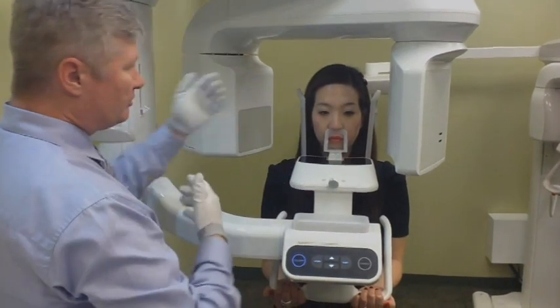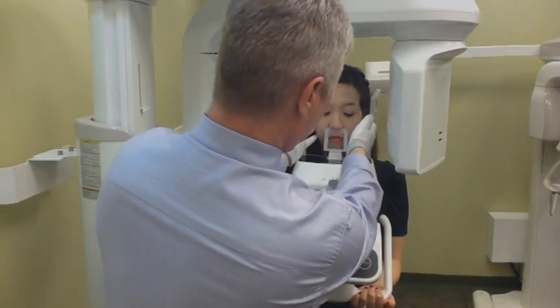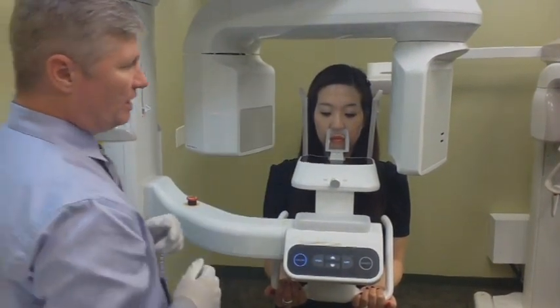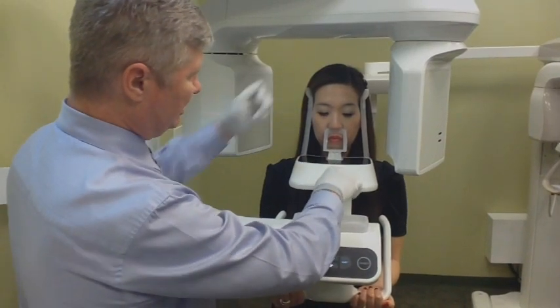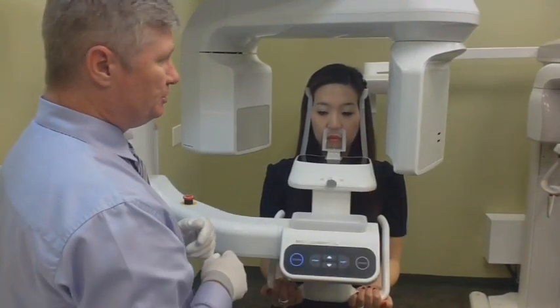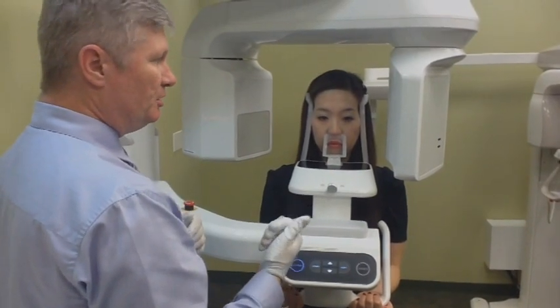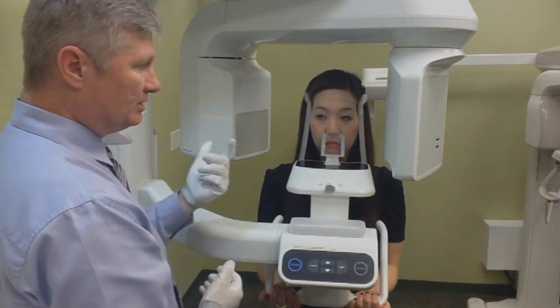The device height should be the same as the previous scan. Have the patient place the base of the nose on the appliance. Verify the Frankfurt light is positioned where it was before, and confirm the mid-sagittal light is still centered — between the eyebrows and at the philtrum above the upper lip. Ensure the canine light is moved as distal as possible. Once configured, rotate the temple rods and apply pressure to the sides of the patient's head until you see a slight flex. For the closed position, instruct the patient to: close their eyes, swallow, bite down on the back teeth, and remain at full occlusion until released.